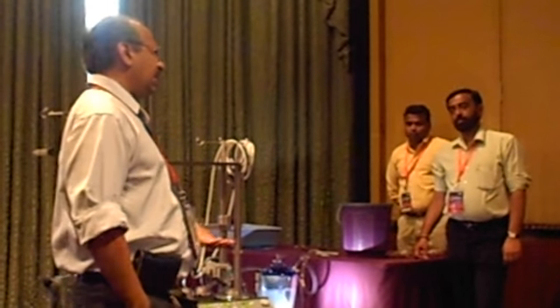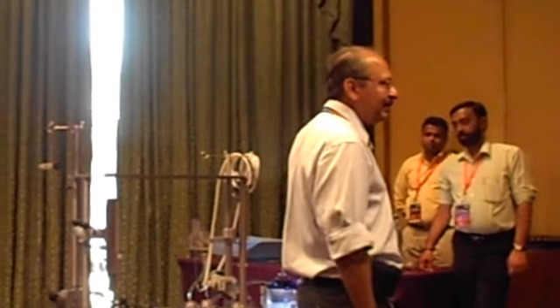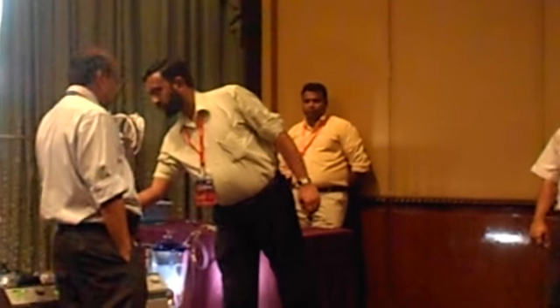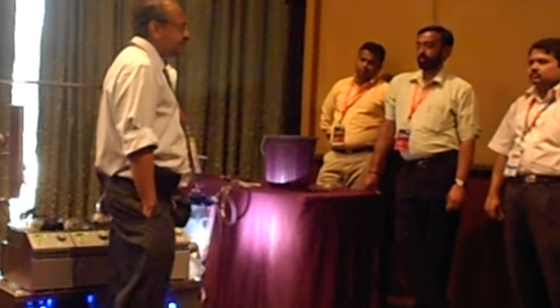What is happening? Oxygenator. Is the oxygenator defective all the time? No. Perfect. You just said oxygenator defective, but I am not saying the oxygenator is defective. You have to check the oxygen supply to the pump. First check whether gas is going. We have the blender. It can get waterlogged by moisture. Sometimes you may even have to run it on 100% oxygen. Understood? Worst comes to worst, bypass the blender if you want.